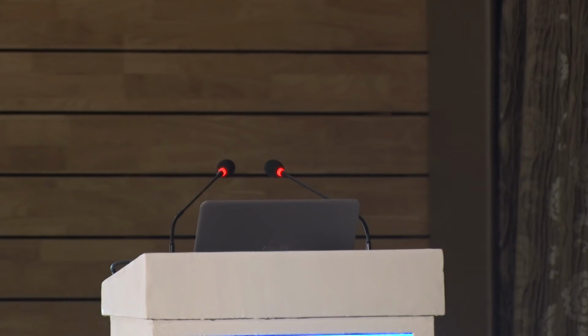Thank you, Dr. Chaudhary. Before Dr. Sharaf does his presentation, just a few comments. One is that whenever you are doing a toric implantation, axis is more important than the amount of toricity. And one should follow the rule of 2 at least. That means 2 pieces of equipment should give the same axis, whether it's an auto-refractor, a lens star, a manual keratometer, or a Pentacam.